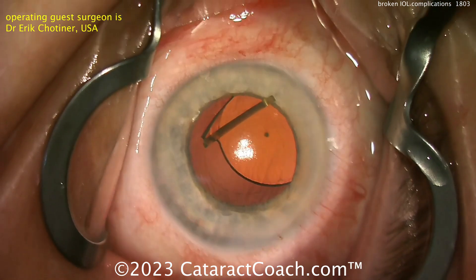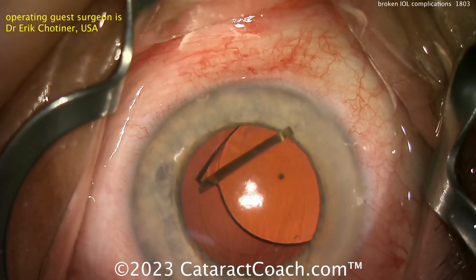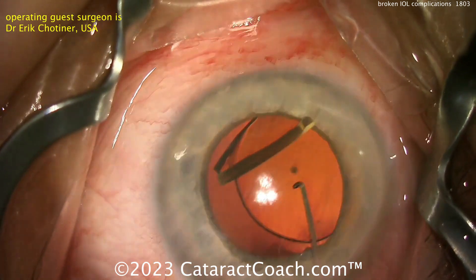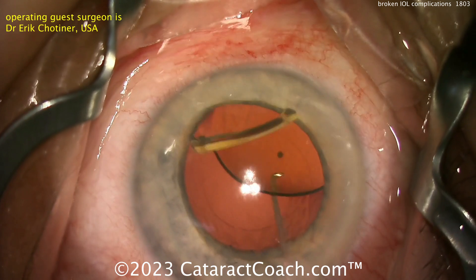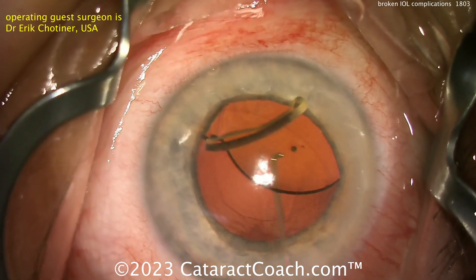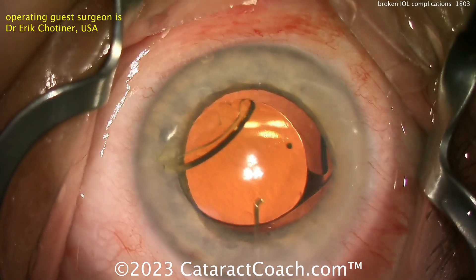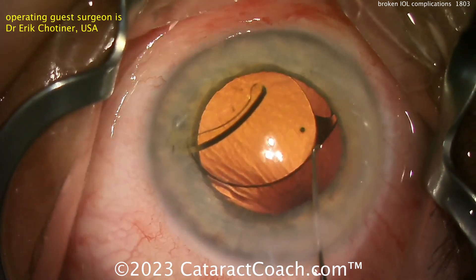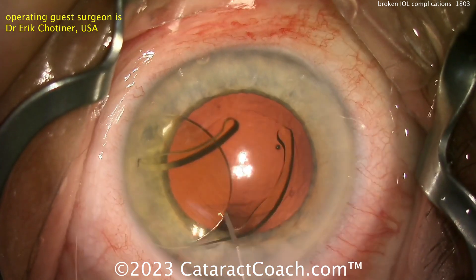For this, I like our twist-and-out technique. You can use that same incision — just pull this thing right out of the eye and twist it. All you need is some tying forceps and a spatula. Go to CataractCoach.com and type in the keyword 'twist' — T-W-I-S-T — in the search engine. The video will come up and you can learn how to explant this lens through the original incision without any special instruments. No scissors, no cutting, nothing.